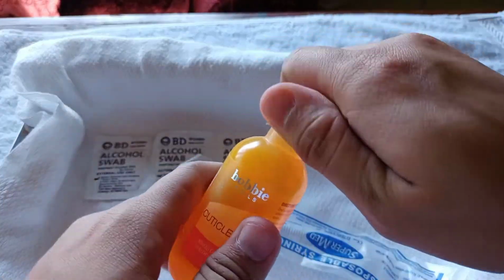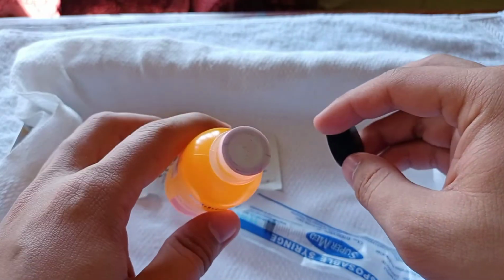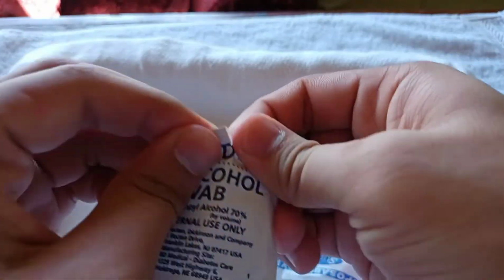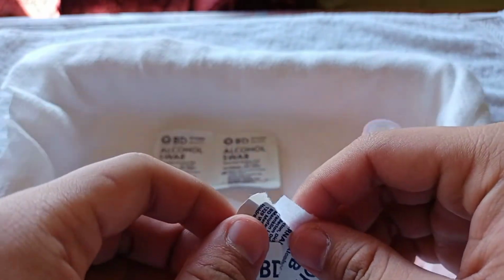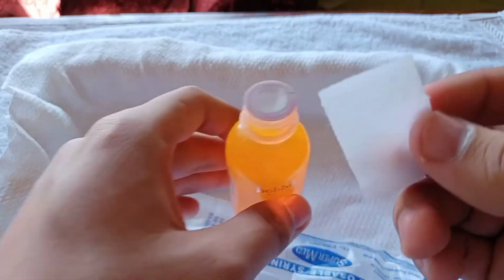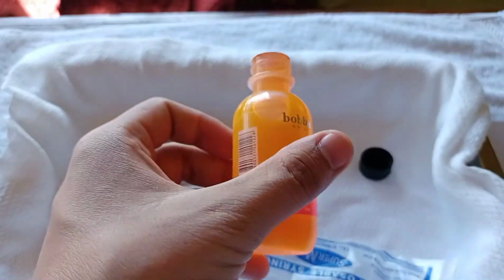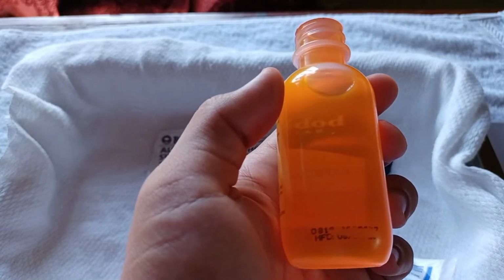Remove the tin sealed cap without touching the rubber stopper. Then you wipe the medication vial with an alcohol swab. Read the label of the medication as well as the amount of diluent you are going to use.